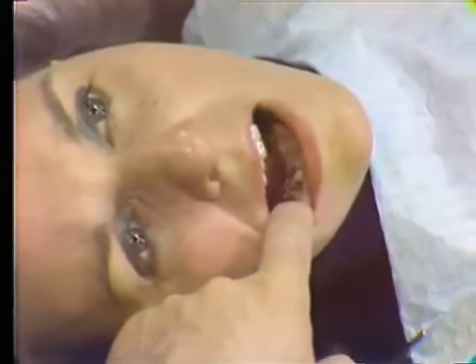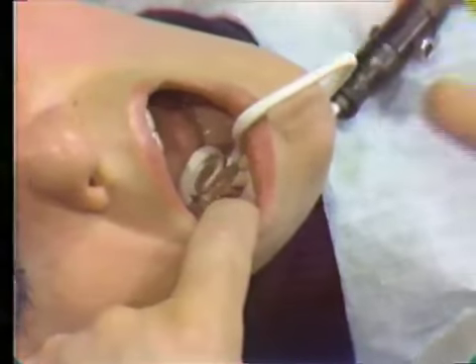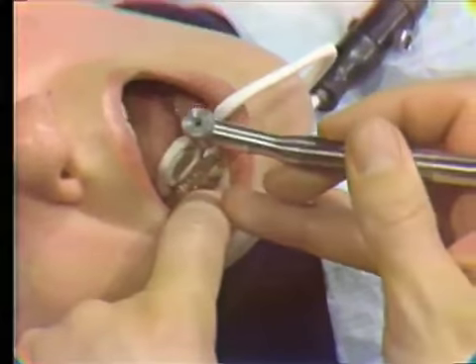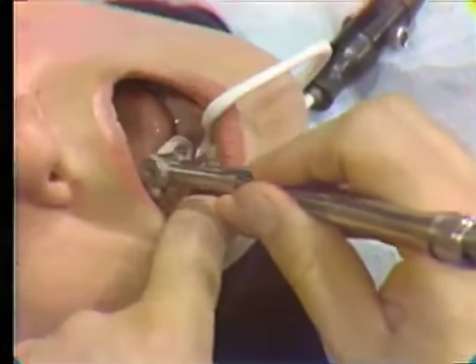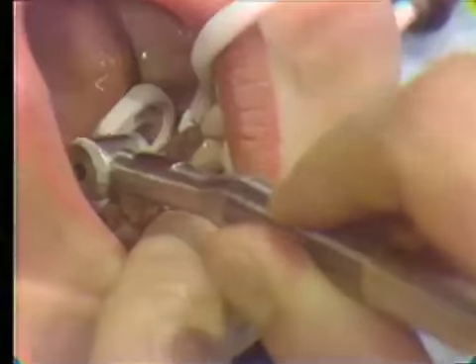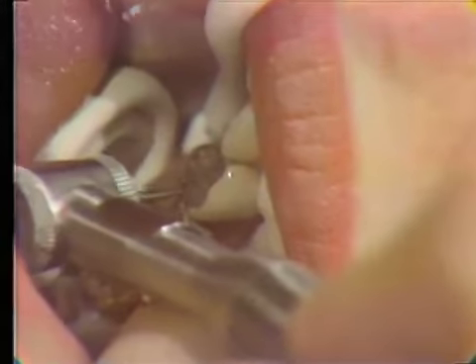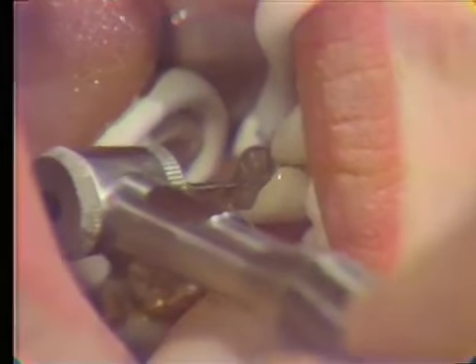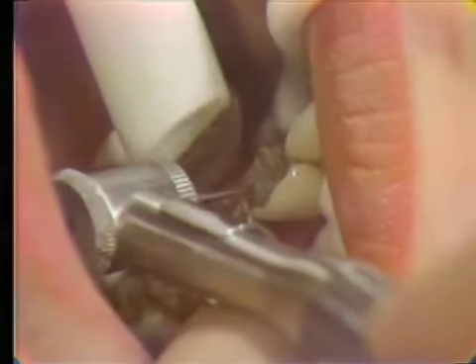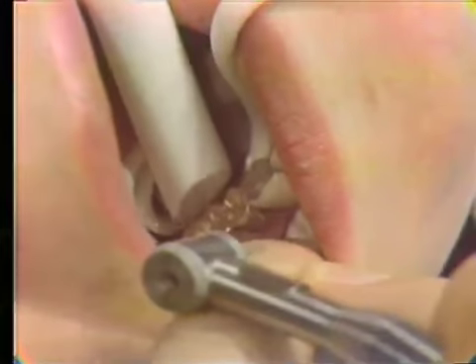The patient's cheek can be retracted with the operator's left index finger. The tongue is retracted with a hygoformic or with the assistant's mouth mirror. The operator's left index finger can be used as a finger rest for the right hand. This allows the handle portion of the handpiece to be positioned toward the operator. This position provides for favorable illumination of the operative field and control for the operator. The evacuator tip opening is placed parallel to the lingual aspect of the teeth and slightly distal to the tooth being treated.